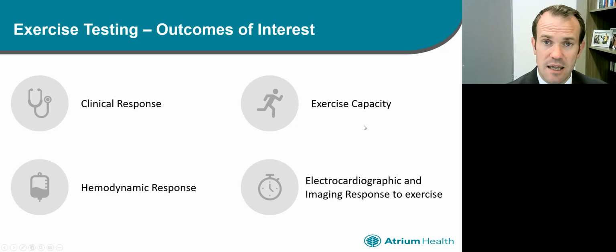Functional capacity is key, and there have been multiple studies published now in almost any pathology you can name, showing that functional capacity is one of the key determinants of prognosis. And then finally, we're going to look at the ECG and the imaging response to exercise.